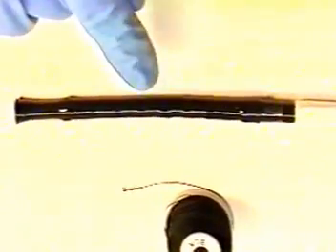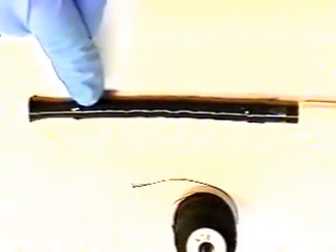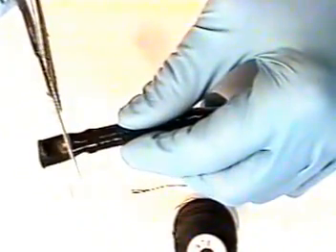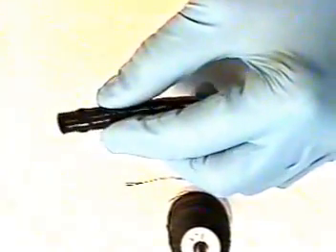We will now bind the bending rubber onto the fibroscope bending section. First, cut off excess bending rubber, being careful not to cut into the insertion tube or distal end. We now use black silk thread. Cut approximately 12 to 15 inches of thread.